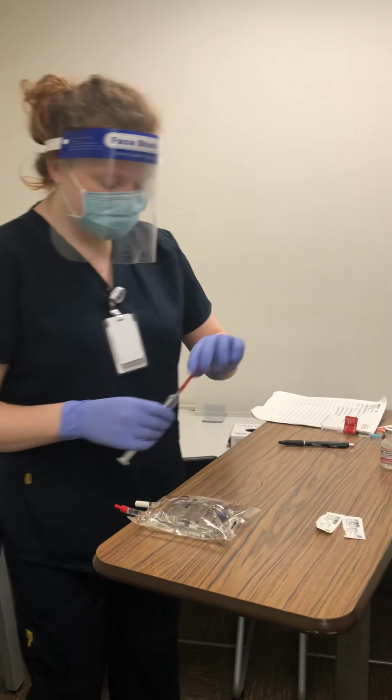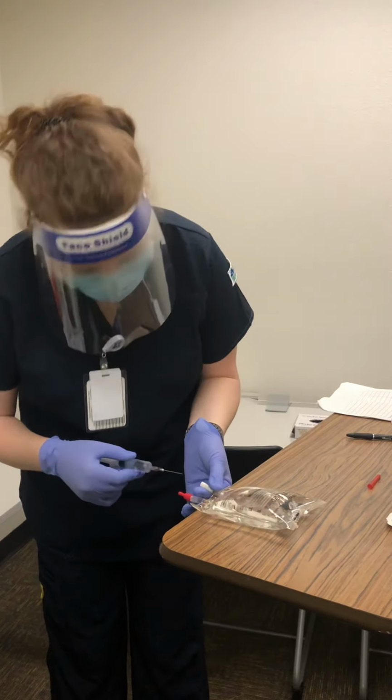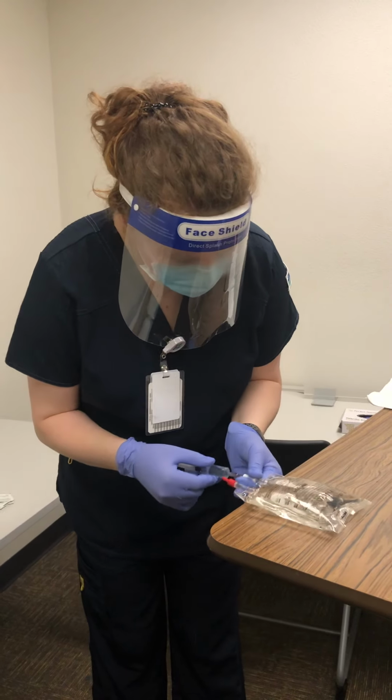And we are going to inject the potassium into our normal saline. We're going straight in and making sure not to poke a hole through the bag.